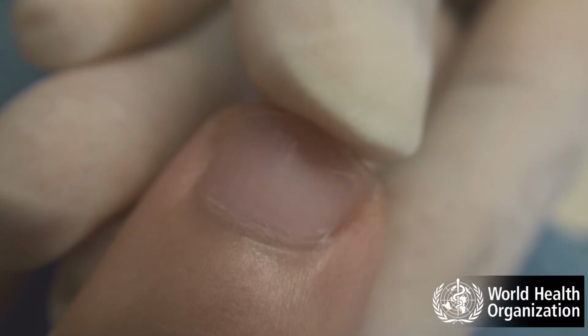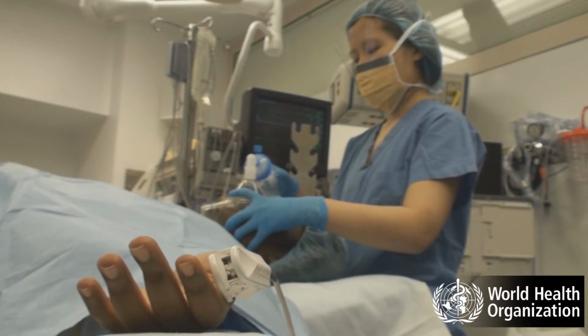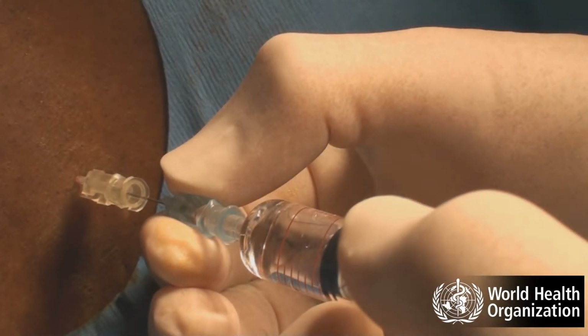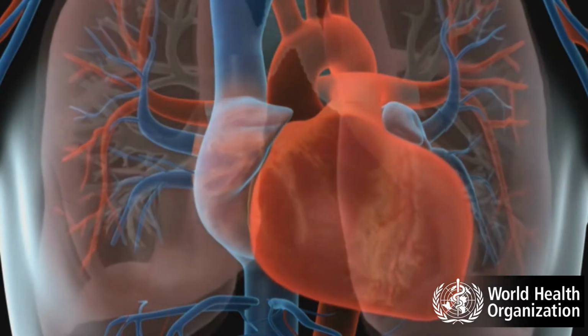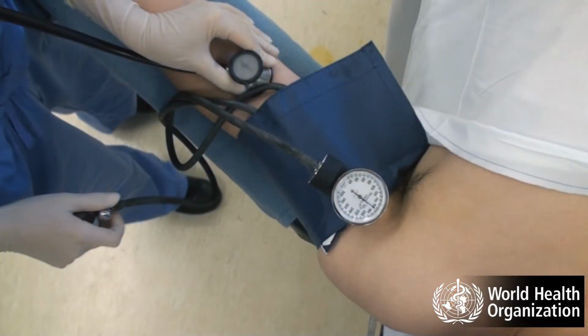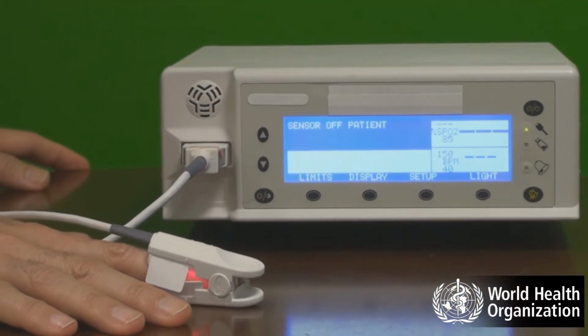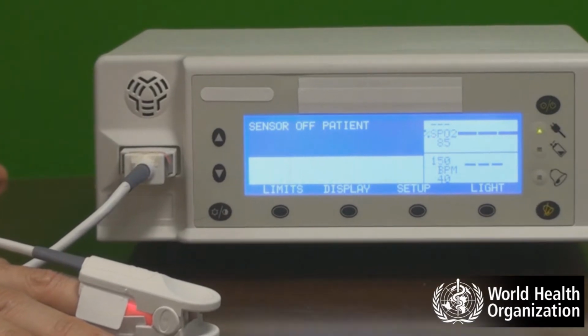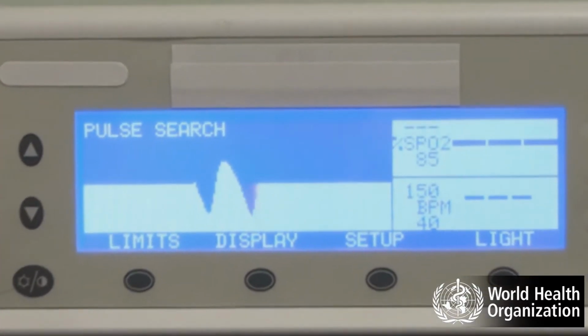C. Is the circulation normal? Is anesthesia too deep? Is there a high spinal block? Is venous return impaired by compression of the vena cava, gravid uterus, or surgical compression? Is the patient in septic or cardiac shock? Normally, an inadequate blood flow is revealed by the pulse oximeter as a loss or reduction of pulsatile waveform or difficulty getting a pulse signal.